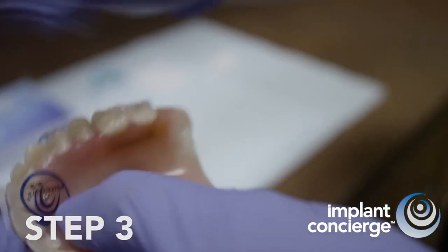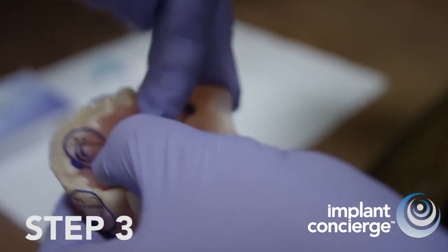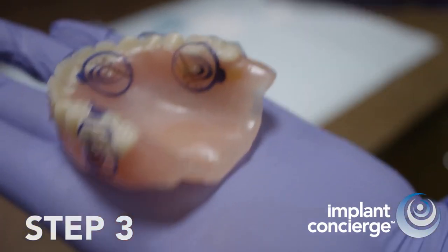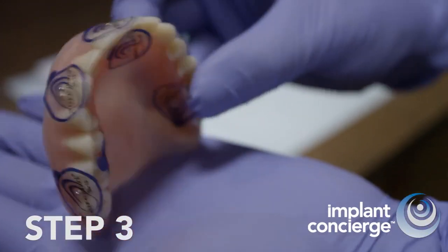Now, peel and stick 3 to 4 x-ray markers on the lingual or palatal surface. It's okay if the sticker protrudes over the edge — trim it or just leave it.